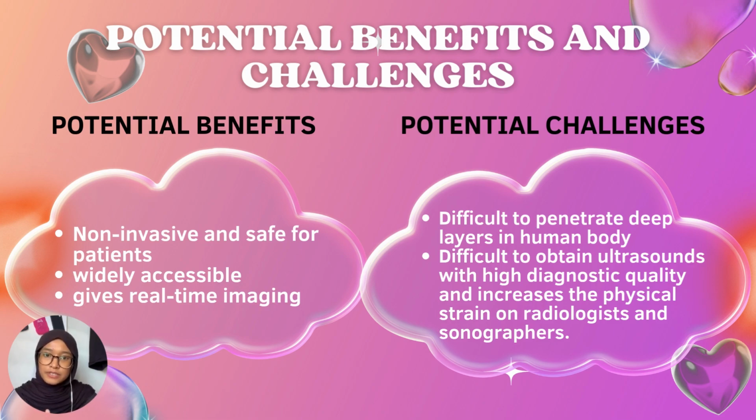Ultrasound may be uncomfortable to patients, but it is not painful. Ultrasound also is widely accessible, including in small hospitals and clinics. It is also easy to use and cost-effective equipment compared to MRI and CT scan. There are also portable ultrasound machines that allow use in different situations, including in isolated locations or by the side of the bed.